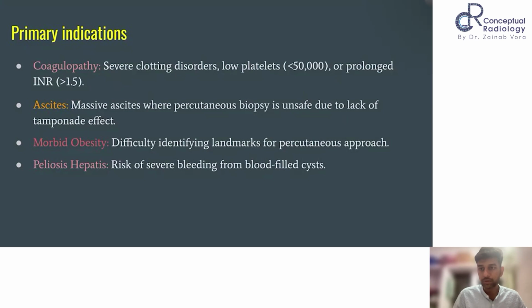So what we do in plug assisted liver biopsy is, once the biopsy is done with the same outer cannula, we inject gel foam as we withdraw the outer cannula. So that is the technique. Yeah, correct, Dr. Kalpana, you're correct. Plug assisted liver biopsy, we can do under FFP cover. Very good. So that is one modification we can do in a setup where IR is not available, and it is also beneficial in a lot of patients.